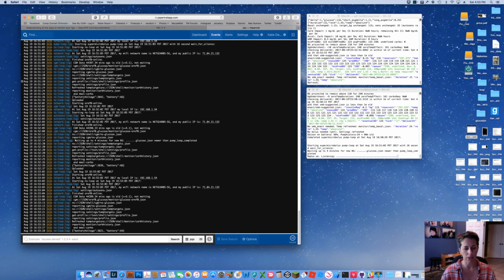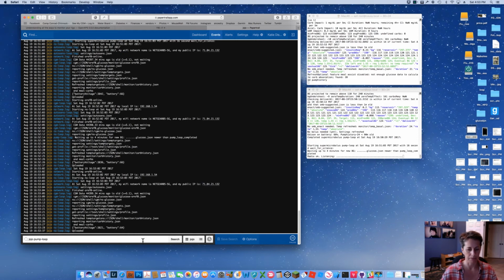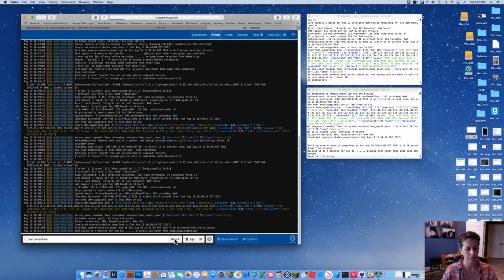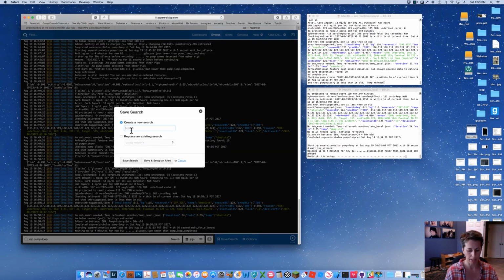So let's do the same for JoJo. We could click on JoJo, which does apply a filter for JoJo, but in order to save it, let's just go ahead and say JoJo pump loop. And we're going to search. There's JoJo's pump loop. We're going to save the search. I'm going to say JoJo pump.